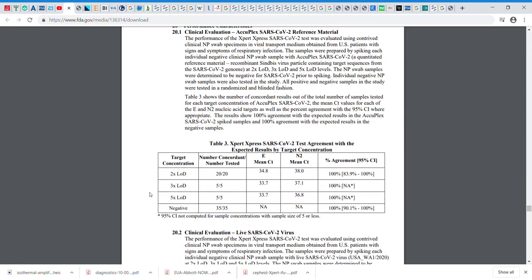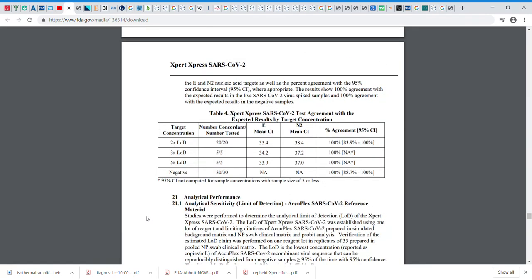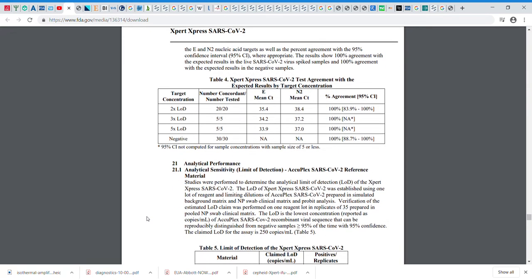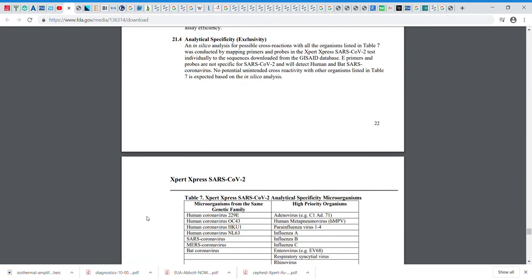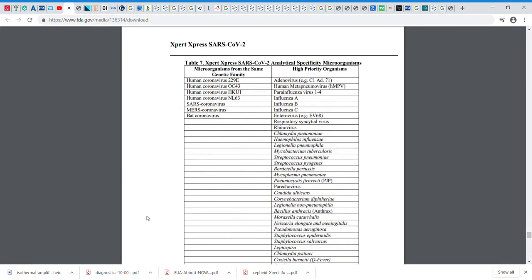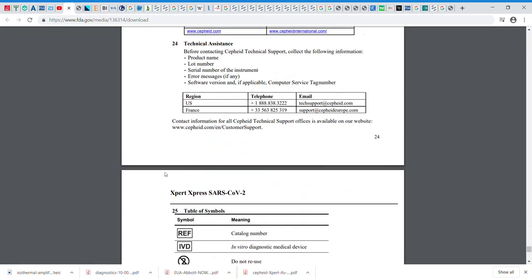And so, again, they have a limit of detection, and they test it, and it's all looking good, right? And here are the other ones that they test for, the high-priority organisms, to make sure they don't mix up and say a positive. And here are their references.